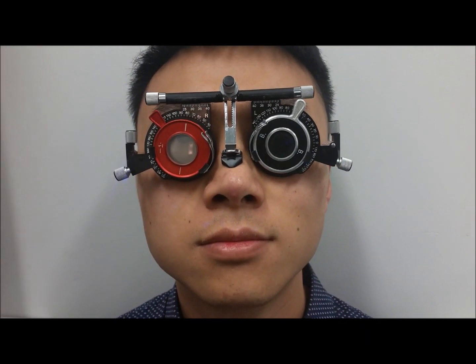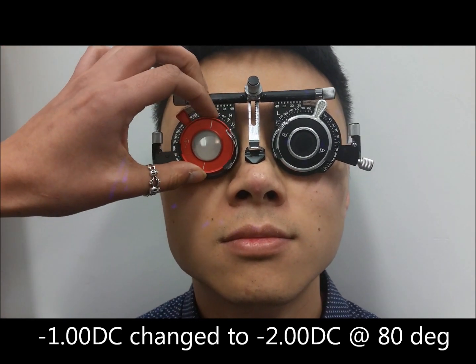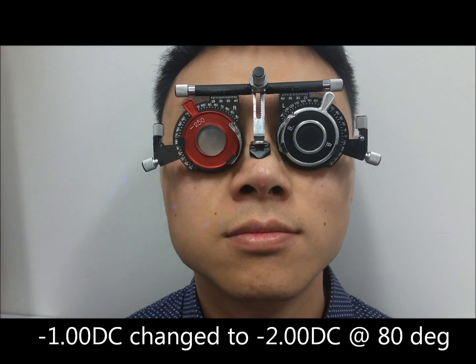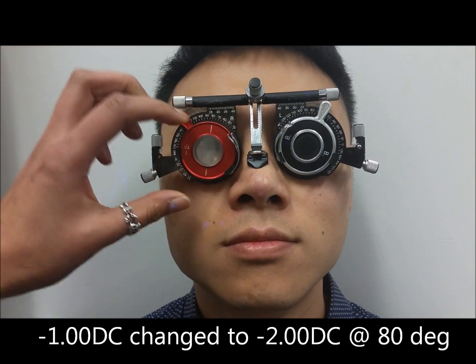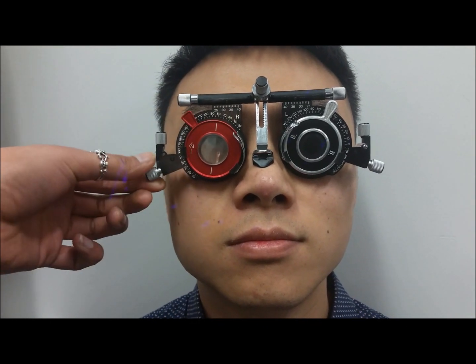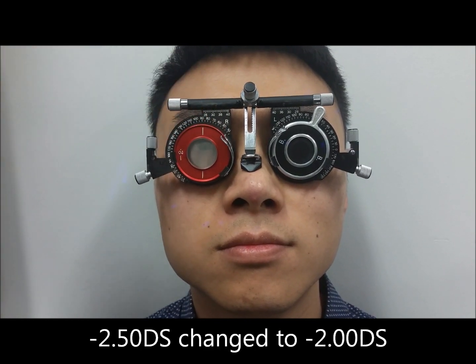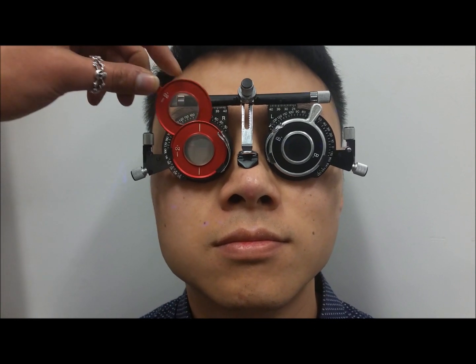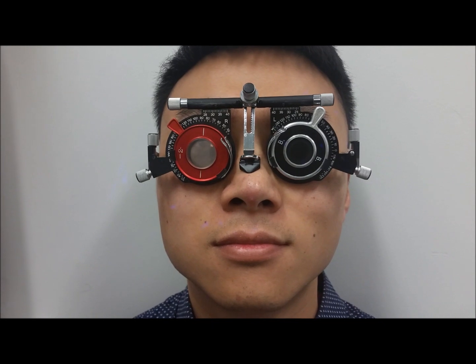As the patient prefers extra cylindrical power, the -1 cylinder lens at 80 degrees is now replaced with a -2 cylinder lens at 80 degrees, therefore adding an extra -1 cylinder power to the script. The spherical component is now changed to -2 diopter sphere, therefore adding +0.5 diopter sphere to the script. This process is now repeated.